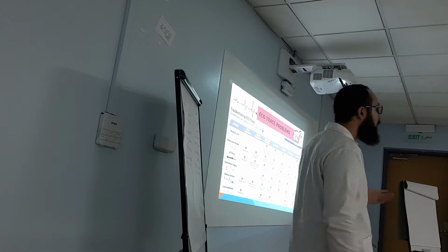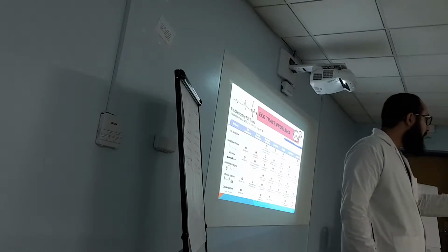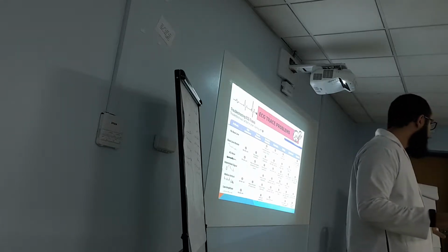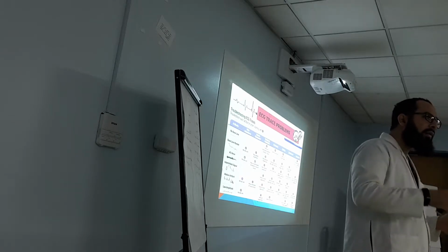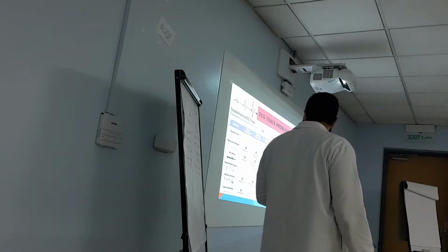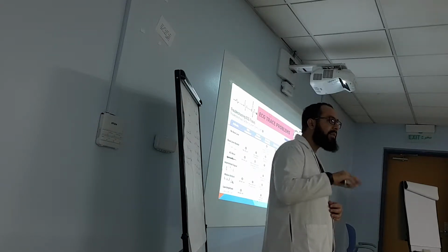Now, if I have a problem with my ECG tracing, how can I solve those problems? After skin prepping, make it a standard. You remove 50% of the causes of artifact in your ECG. No need to write again, print again, try again. If you prepare the skin properly, you remove 50% of the problems. So what are the other 50%? The remaining is the machine. So, patient and the machine.